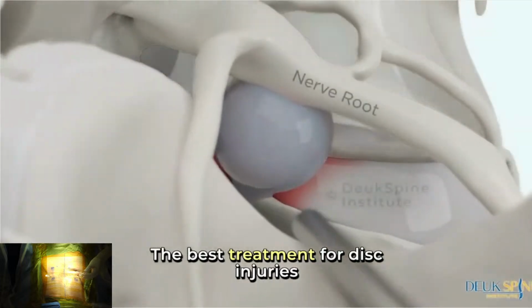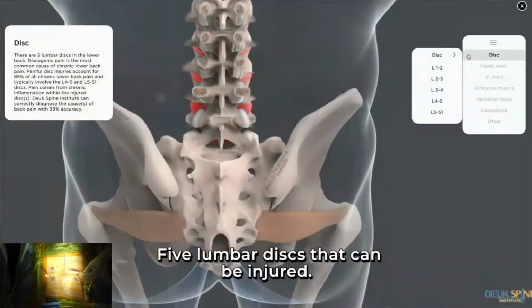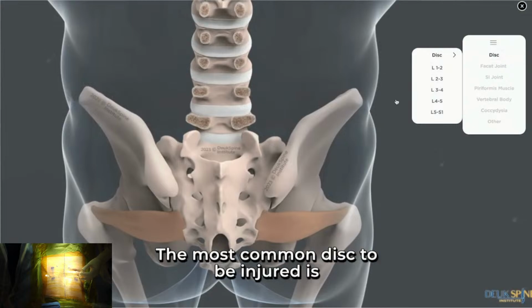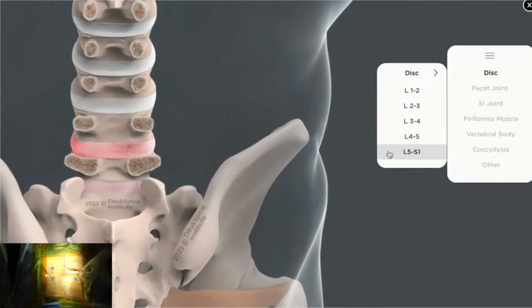The best treatment for disc injuries is Deuk laser disc repair. Let's take a look at the 5 lumbar discs that can be injured. The most common disc to be injured is L4-5, followed by L5-S1, then L3-4.